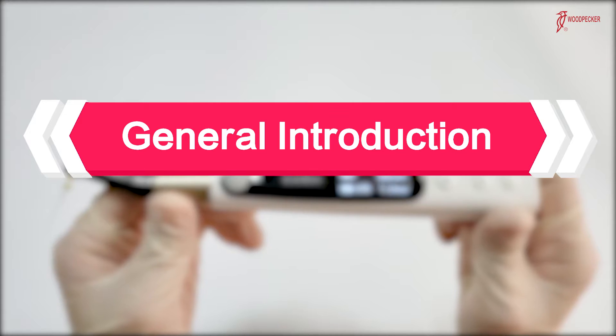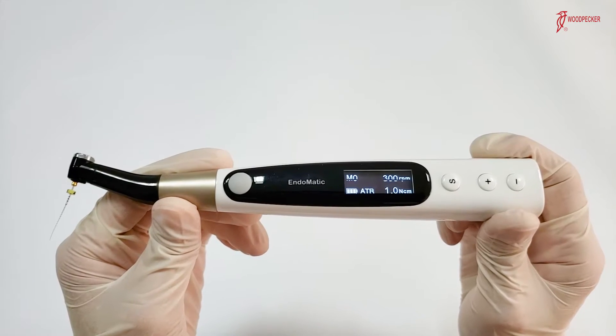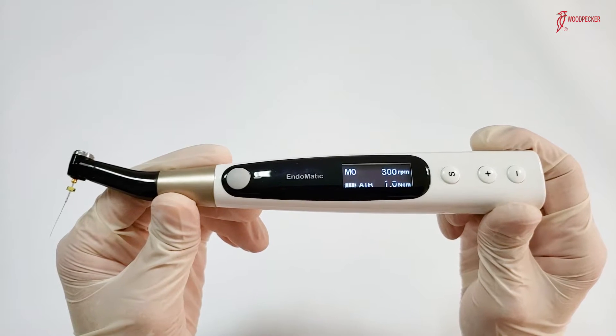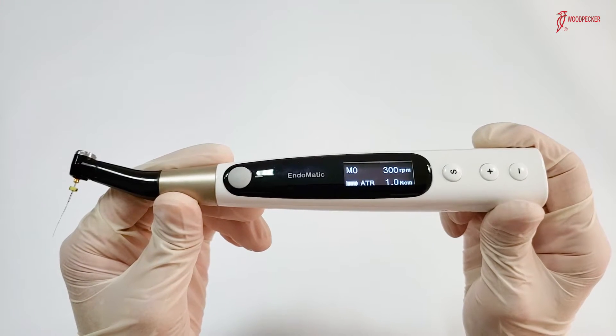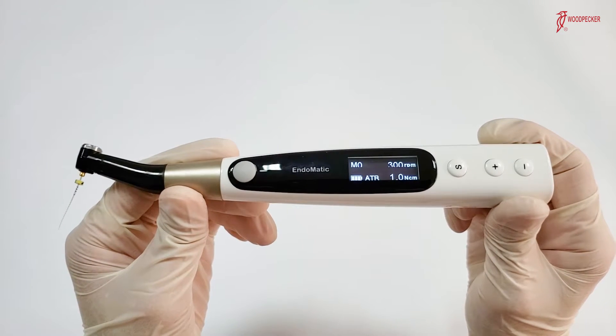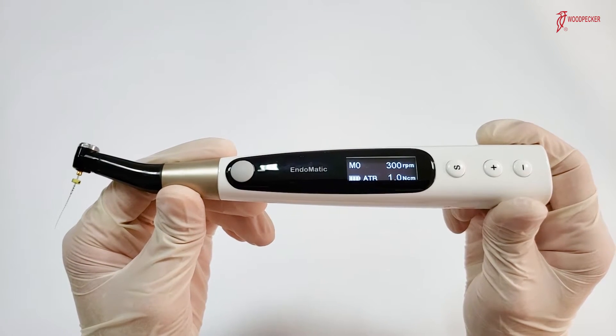Hello everyone, today I would like to introduce Woodpecker's new endomotor, EndoMatic, to you. EndoMatic is a full functional endomotor. For example, it's integrated with Apex Locator function and has all market-famous file systems preset inside.